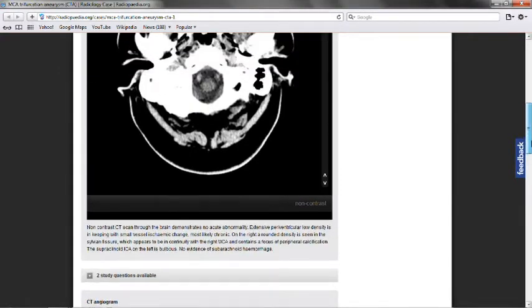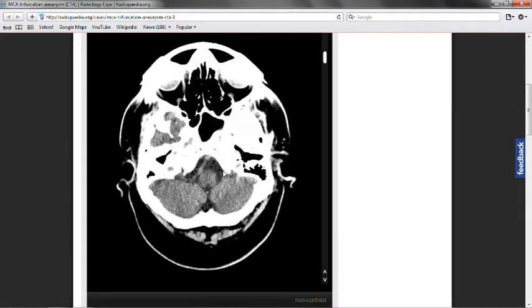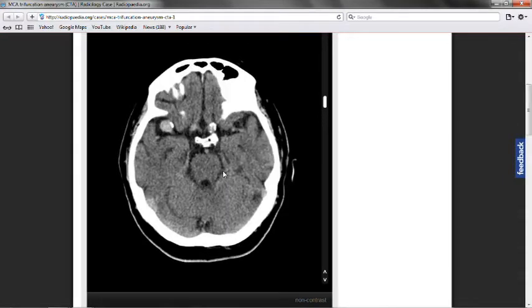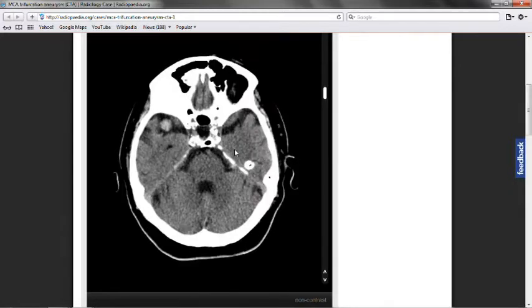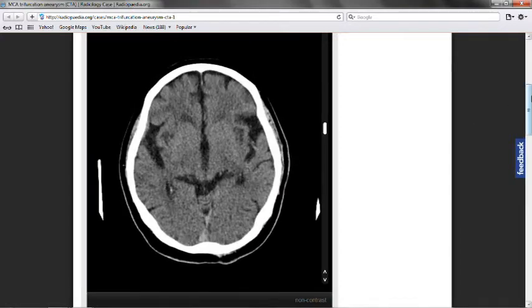Okay, here is an aneurysm that has not ruptured yet. As we're scanning through, notice we have this area here. Notice how round it is, and we can see that there is a vessel supplying it. There are calcifications inside of it, as we can see here. And so that is an aneurysm.